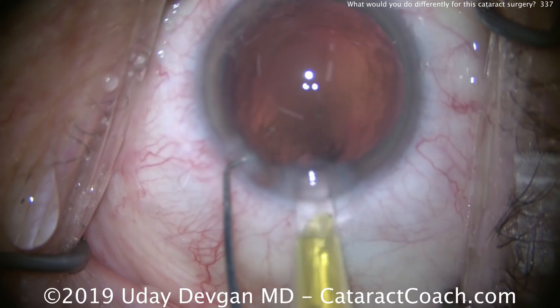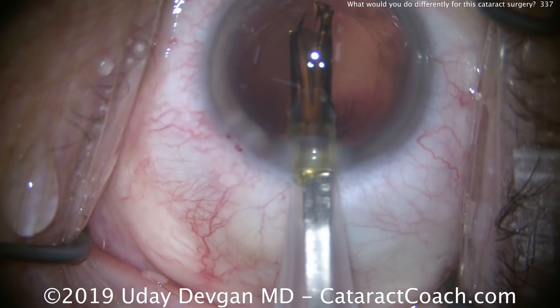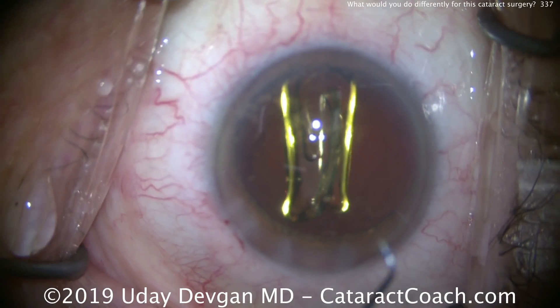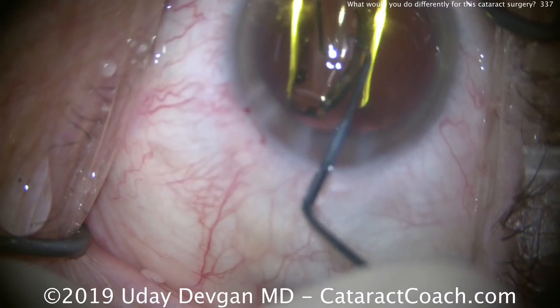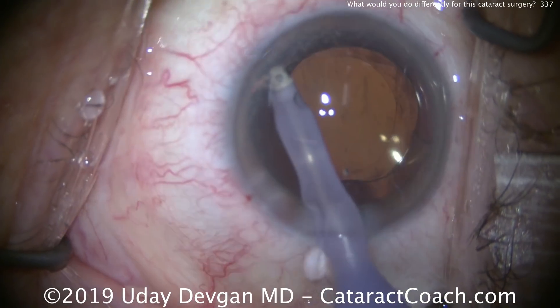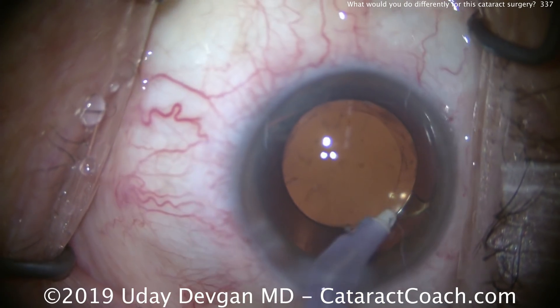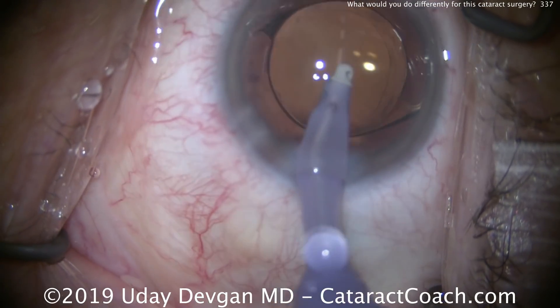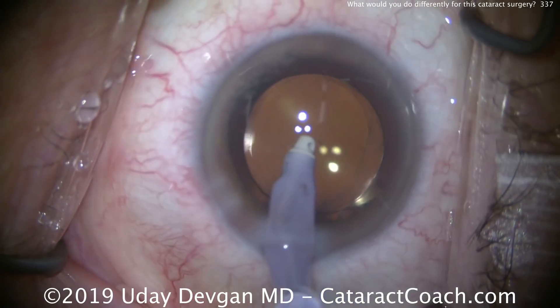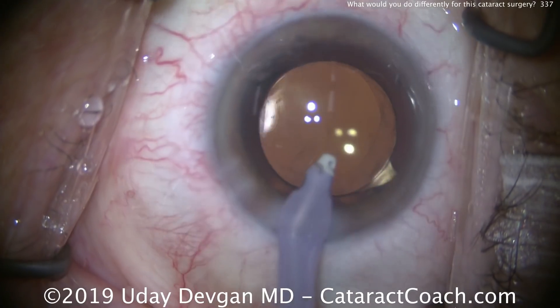Here comes the IOL. We'll put that in the capsular bag. You can still see we have good protection with the dispersive viscoelastic. The rest of the case proceeds pretty normally. We do want to minimize the patient's post-op refraction — in this case we did aim for plano. We also want to minimize post-op inflammation. Here's removing the viscoelastic from the eye; we're careful to remove most of it, almost all of it, but we don't want to be very aggressive with fluid flow near the endothelium. Lens is nicely positioned, good overlap with the capsorexis.